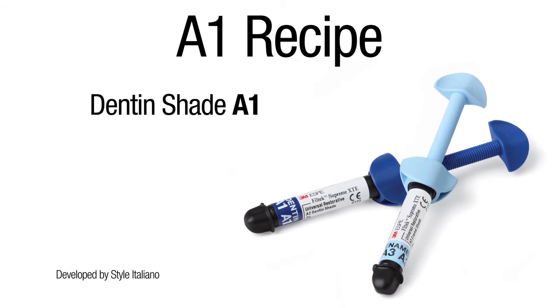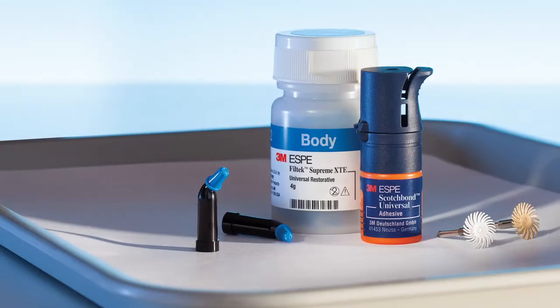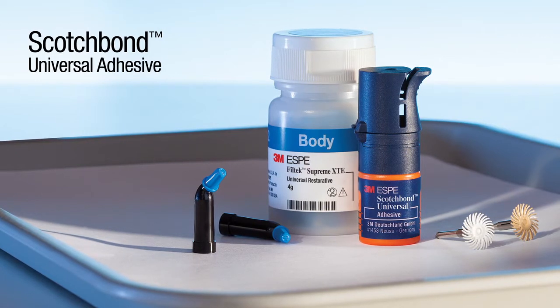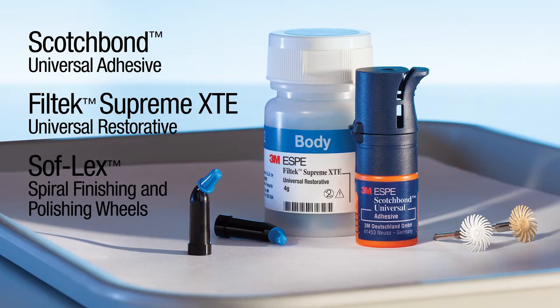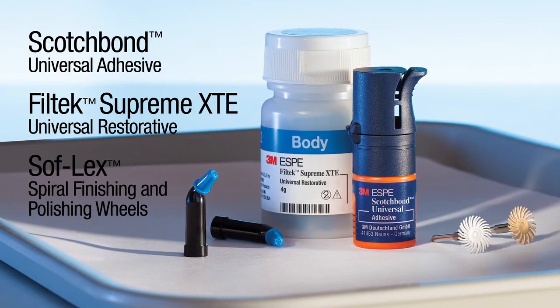The recipe uses Dentin shade A1 and enamel shade A3 of Filtek Supreme XTE Universal Restorative. The products used during the procedure include Scotch Bond Universal Adhesive, Filtek Supreme XTE Universal Restorative, and Soflex Spiral Finishing and Polishing Wheels. Together, they optimize the outcome and maximize the simplicity of the procedure.